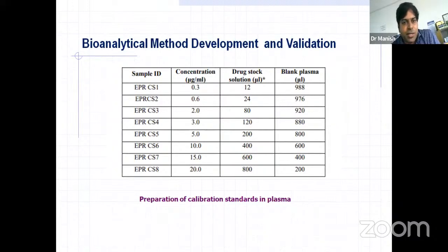And to my knowledge, the new ICH M10 guideline will solve many questions, because lots of confusion was there about which method should be followed. Many of them are following USFDA guidelines so far, till today. So this M10 guideline will give much information regarding methods in future.